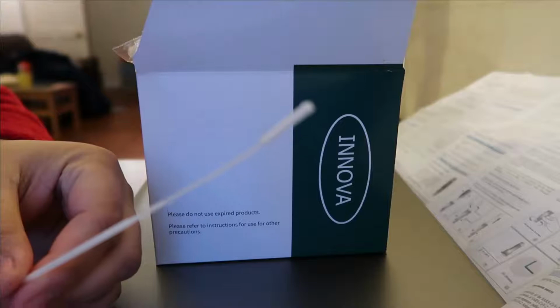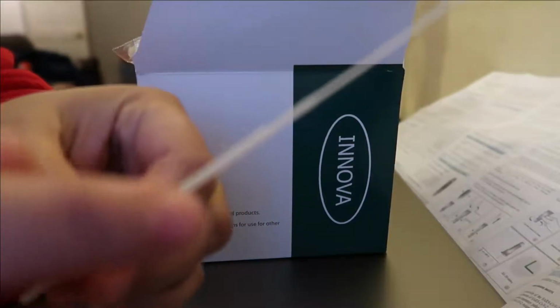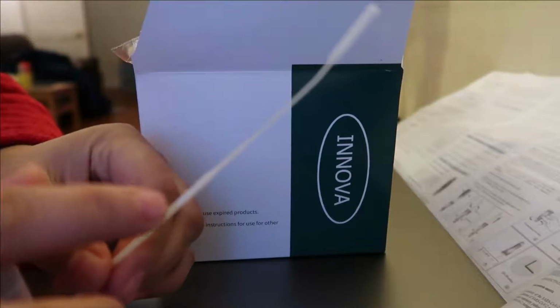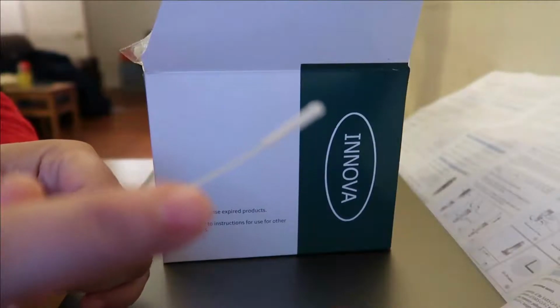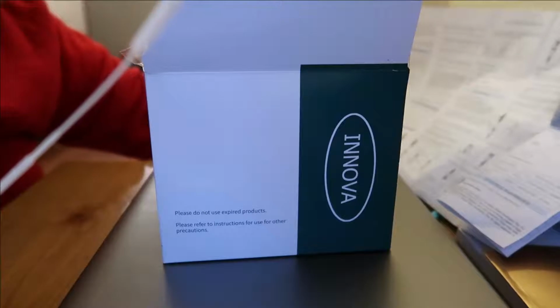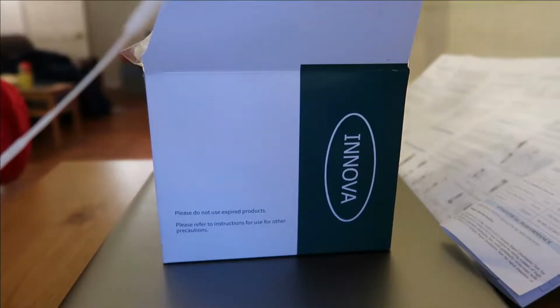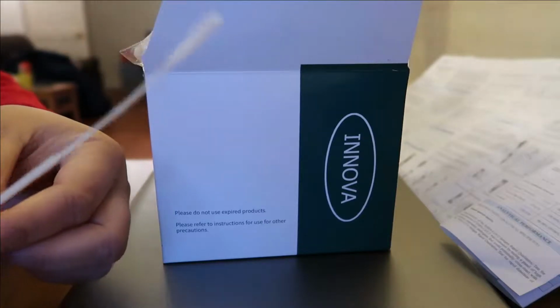So the instruction is, I'll show you first on this. I don't know if you can see, but there's like, how do you say it, the end of a cotton bud. Okay, the instruction is to insert it up to 2.5 cm, that's about an inch, from the edge of the nostril. So from the edge of the nostril, go 2 to 2.5 cm. So I'm going to do that now.